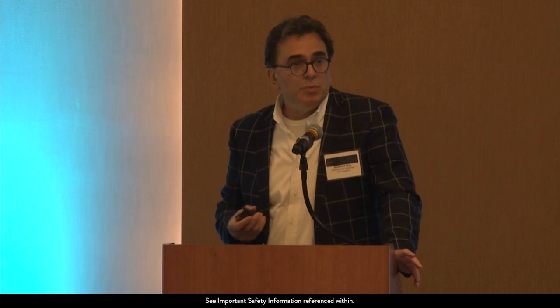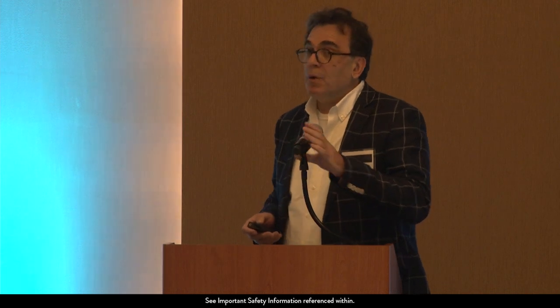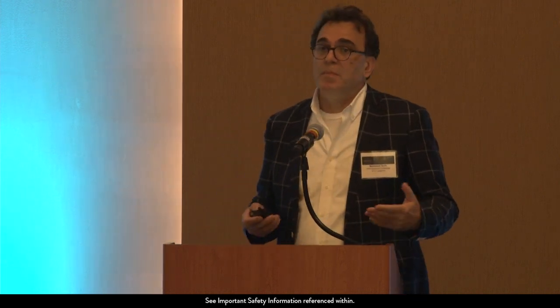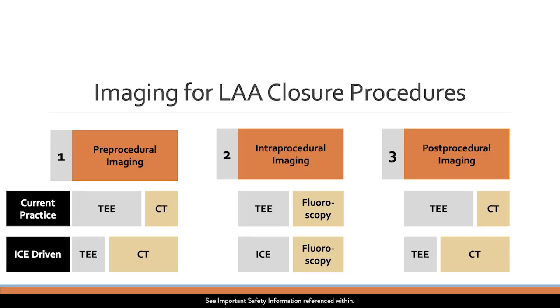In my institution, we do not require pre-procedural CT imaging. However, that doesn't mean that we do not use CT imaging pre-procedurally, because, as you know, many of the same patients who undergo left atrial appendage occlusion are also the patients who might have had a prior atrial fibrillation ablation, for which they then had the CT. So we can repurpose this free CT for pre-procedural planning for the left atrial appendage.